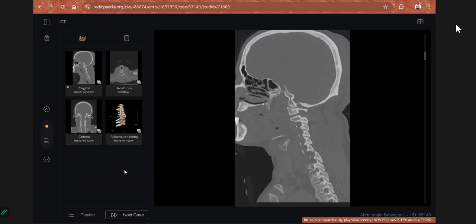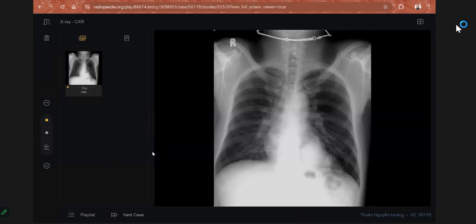Okay. So this is your next case. Yes, sir. Okay. Sir, I'm provided with a radiograph chest of a patient, and the first obvious abnormality I could appreciate is a retrocardiac opacity on the left, and it appears rounded. Another additional tiny opacity is also seen closer to it. Otherwise, the lungs are clear.